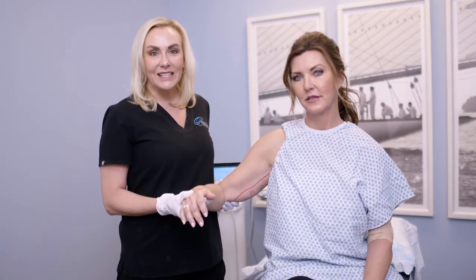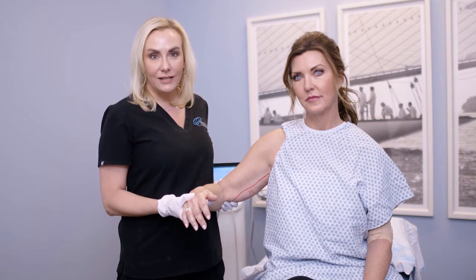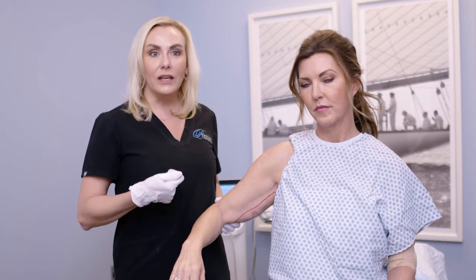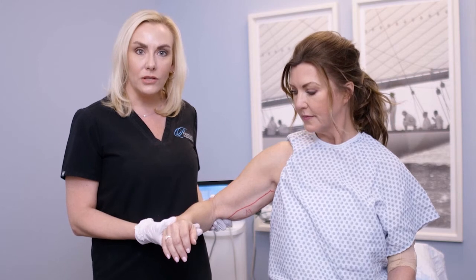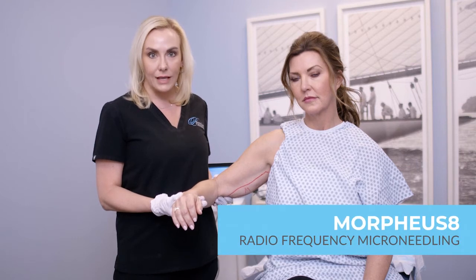Once that cannula is in place, we are gonna heat the fat tissue and the subcutaneous tissue. In order to do that, we are going to use this cannula, moving it back and forth. Once we reach that goal temperature, then we will move to any other areas that we want to treat with that device. Once that part is done, we will do the Morpheus, will be the next segment.